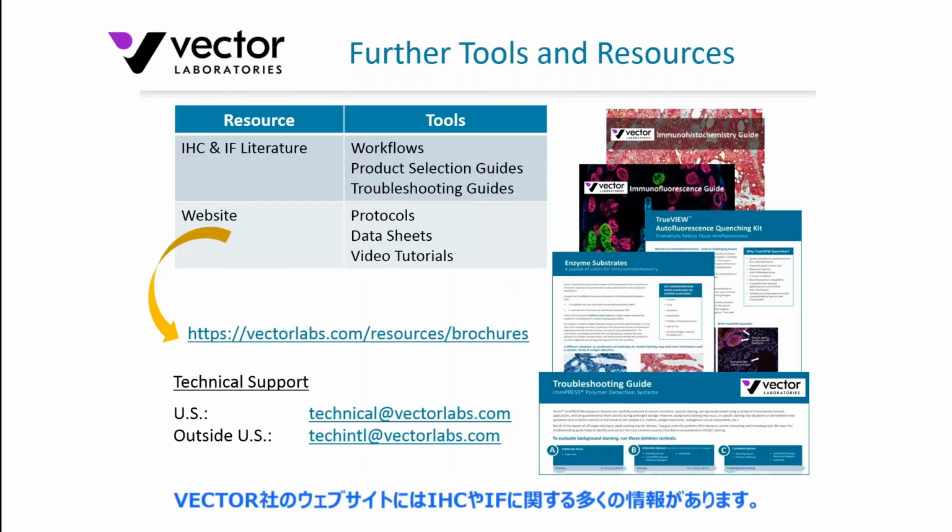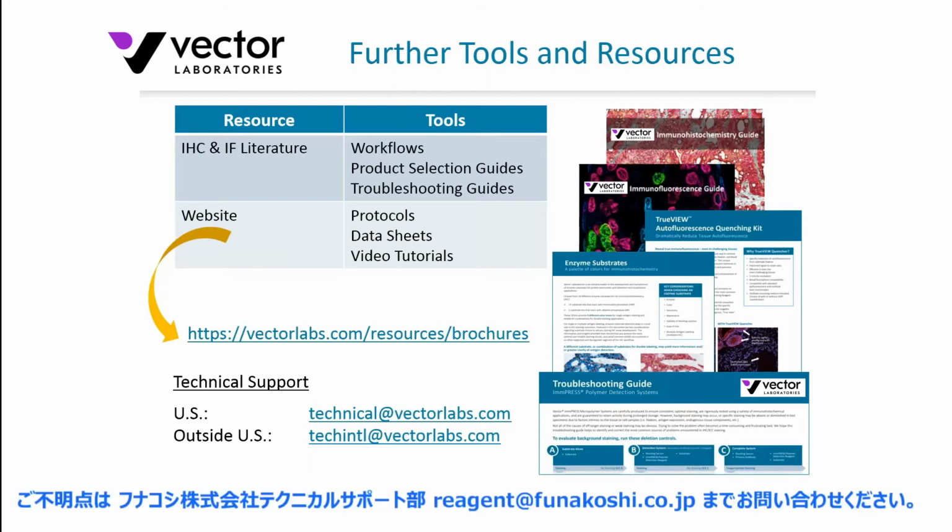So just to sum up, we do have, I'd say, a plethora of information available on our website: various guides, immunohistochemistry, immunofluorescence, some workflows, some troubleshooting guides. Please check those out if you'd like further help in this area. And also we are just an email away in terms of our technical support.